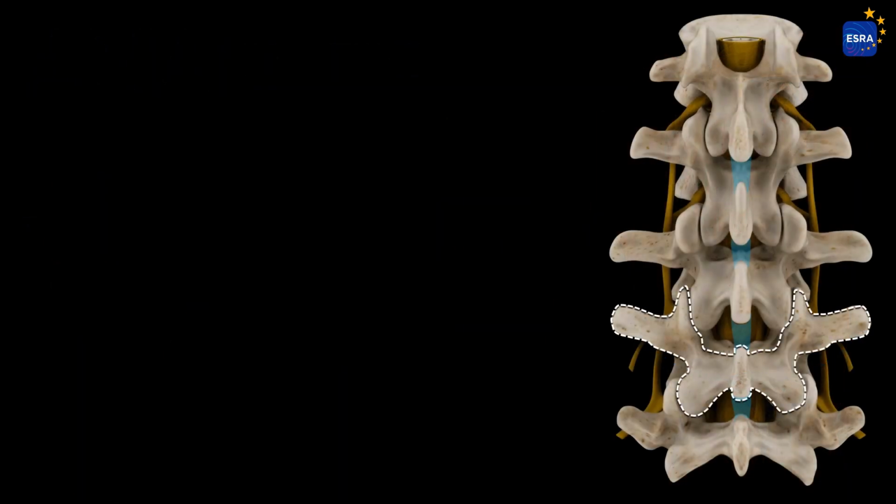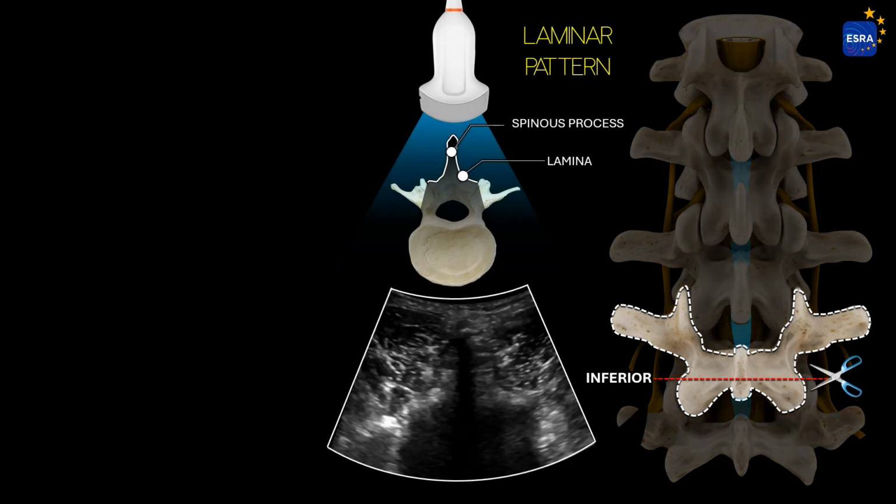For an axial examination of the lumbar spine, when placing the transducer over any spinous process and lamina, with the patient seated or in a lateral position, the spinous process appears as a sharp, hyperechoic reflection beneath the skin and subcutaneous tissue, continuing with the acoustic shadow of the lamina, which completely obscures the underlying spinal canal and consequently the neuroaxial structures. Therefore, this view is not ideal for imaging neuroaxial structures, but is useful for identifying the midline when the spinous processes cannot be palpated, such as in obesity or individuals with significant edema.